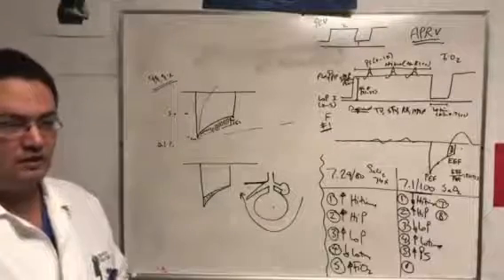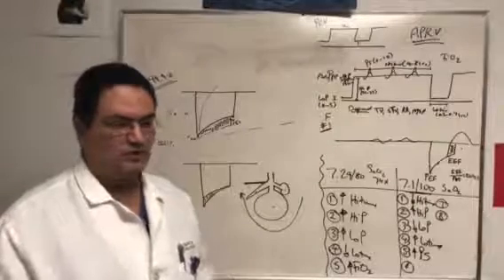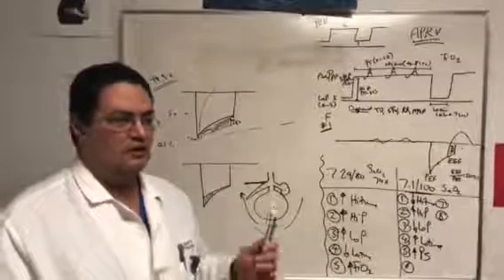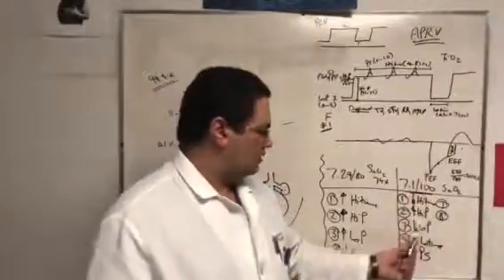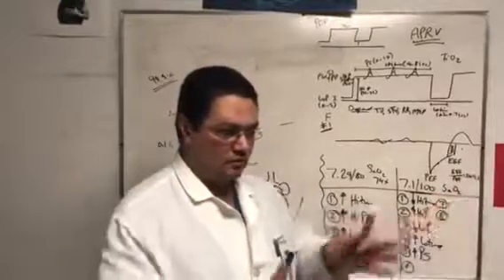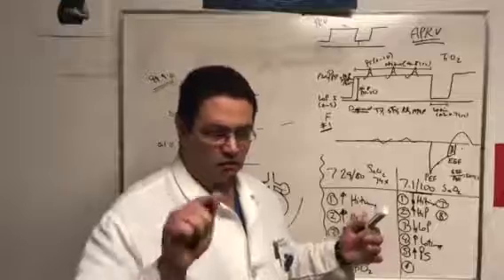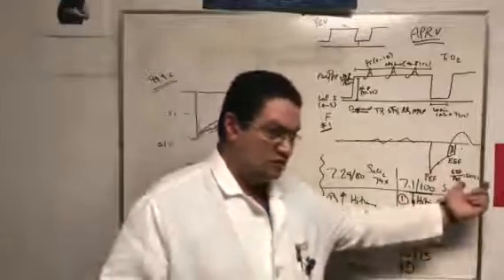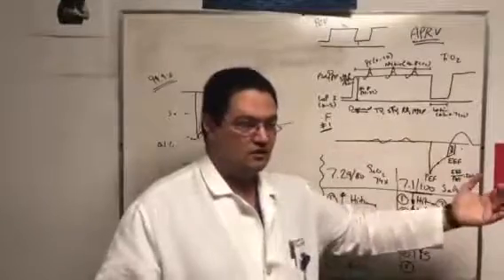The only problem with that is that it's almost like throwing in the towel early, throwing in your white towel early, because when I say increase the low time, you will never come out of this ratio. You're always going to remain within the ratio, that goes without saying. So we're moving within the ratio, right? The ratio was 60%, I'll make it 30%.